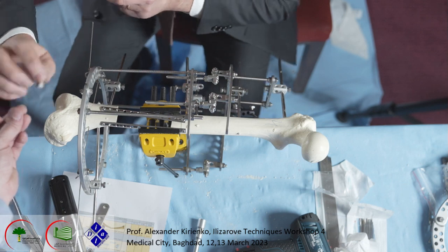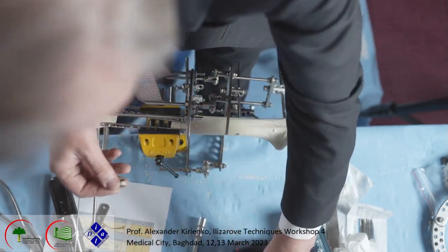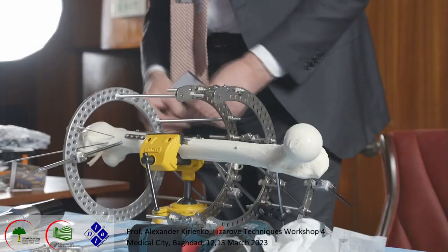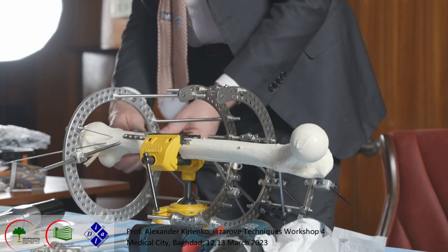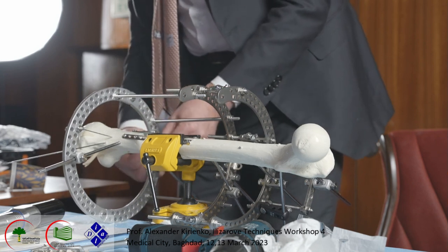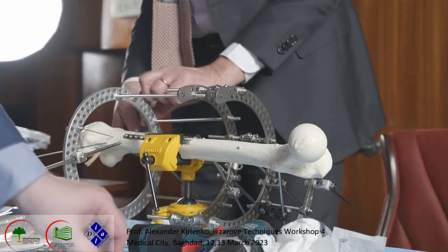Yeah, we have. I saw one with a hole. We don't have a hole. Yes, with the hole, because it goes in center, I use the bolt with the hole. Thank you.